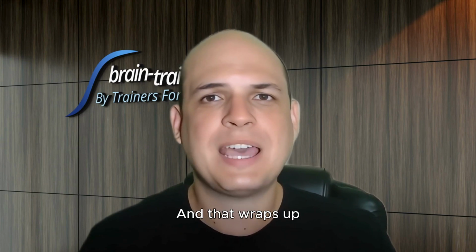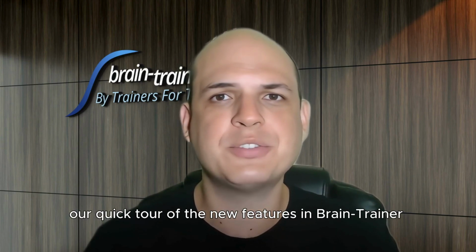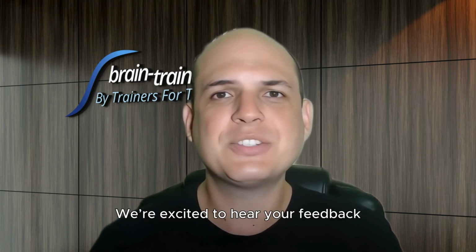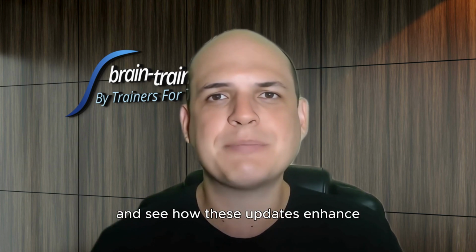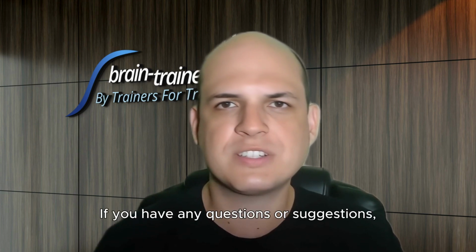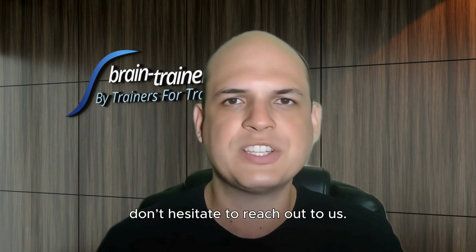And that wraps up our quick tour of the new features in Brain Trainer version 2.25. We're excited to hear your feedback and see how these updates enhance your training experience. If you have any questions or suggestions, don't hesitate to reach out to us.